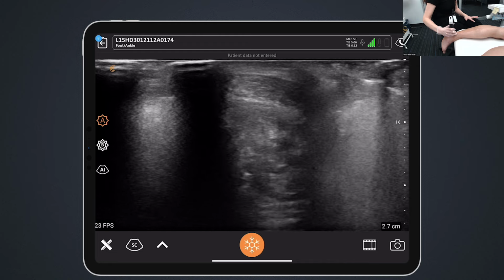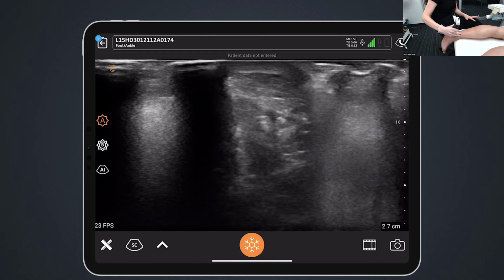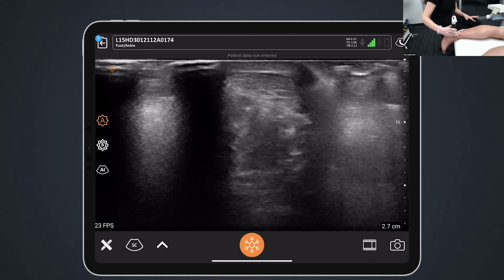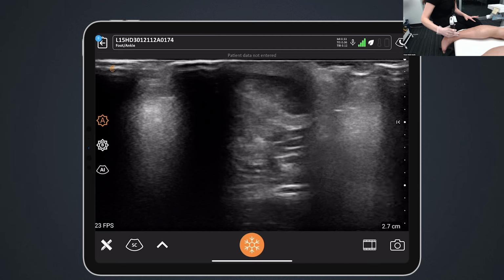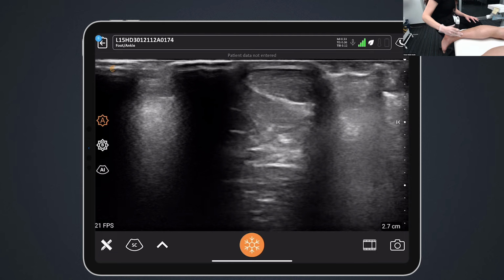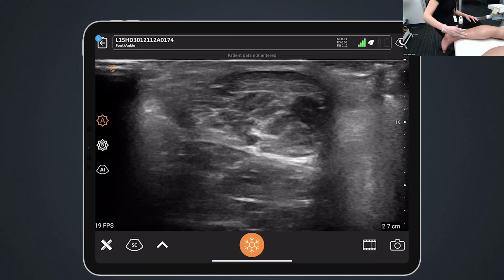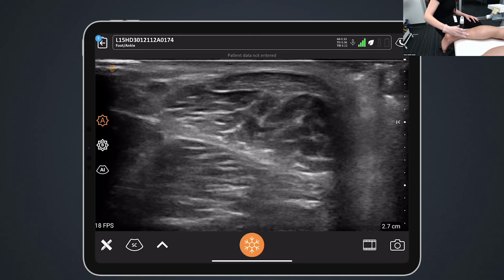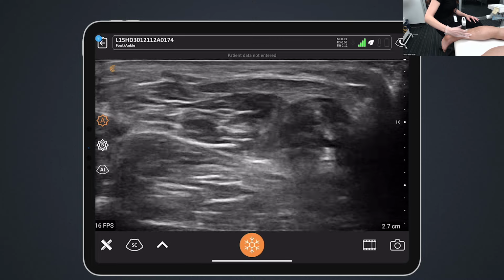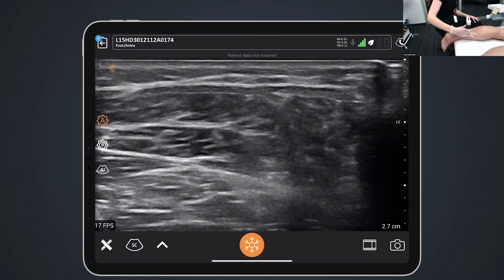And we can use that anisotropy again. So a normal tendon, when we tilt the probe, turns dark. That indicates that we are seeing the tendon as we rock the probe. So when we're at a 90-degree angle, it's nice and hyperechoic. So we'll scan all the way from distal, proximally, the soleus muscle comes into view there. And the tendon kind of expands outward as it extends into the soleus and the gastrocnemius again.